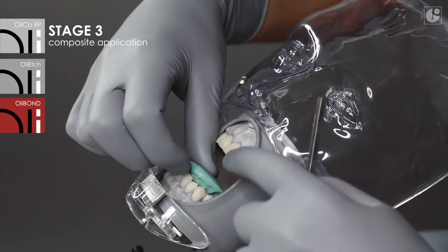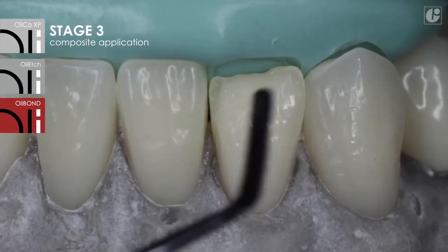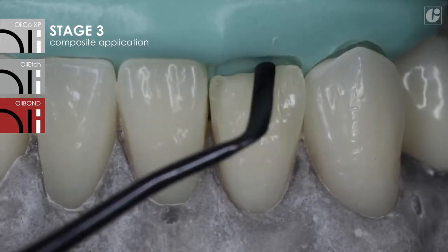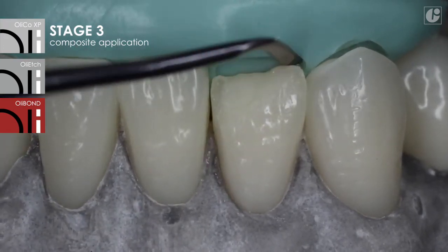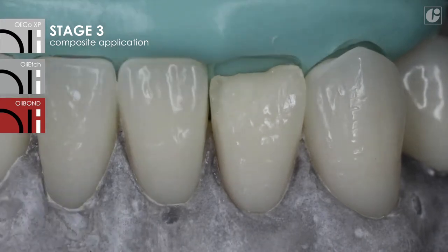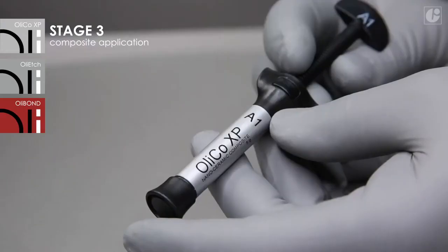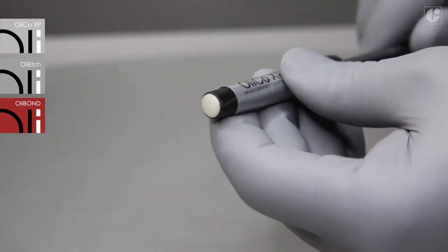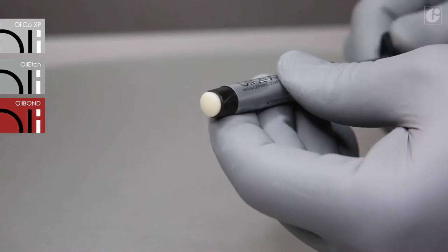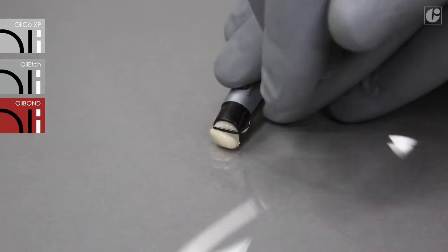A silicone index has been prepared for the aesthetic reconstruction of the frontal section, which makes it easier to work in the first phase of composite material application. An Oli Silsi A silicone material was used to prepare the index. The reconstruction was planned in accordance with the three-dimensional layer technique, while suitable composite shades were selected in relation to a moist tooth.